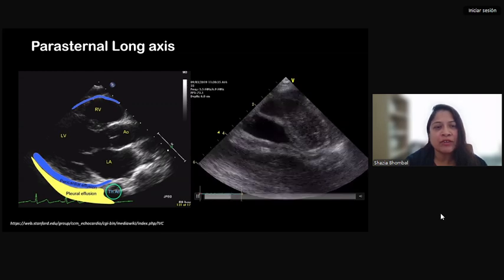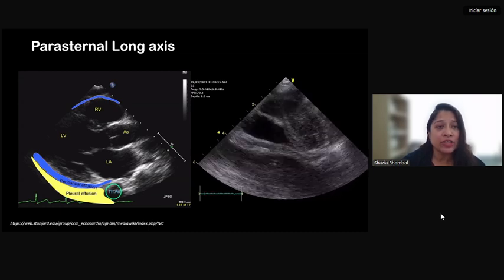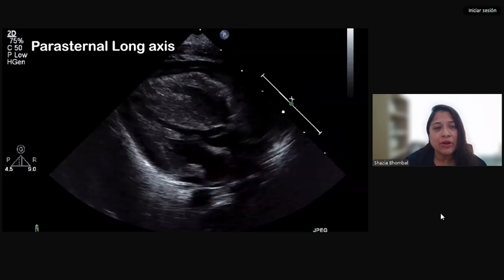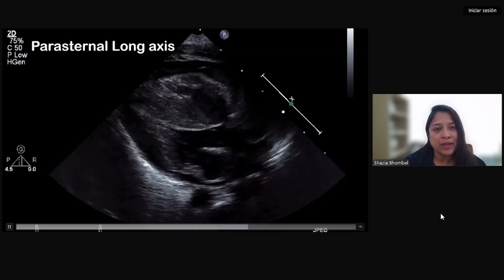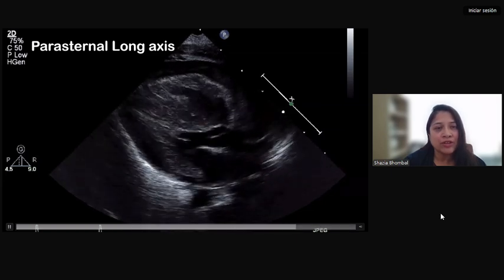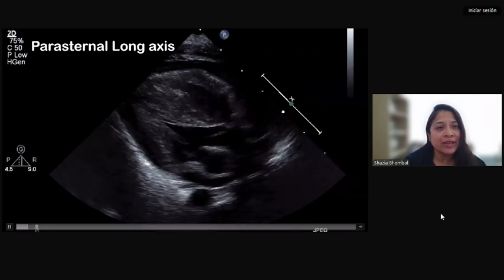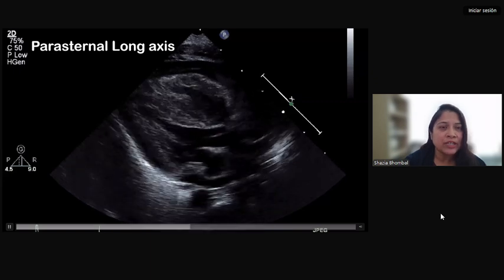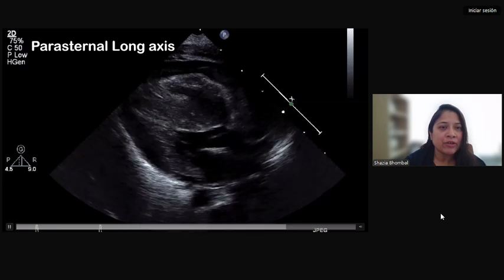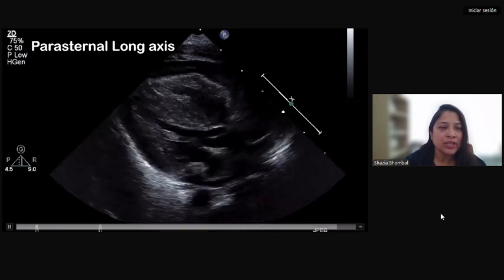And here, trying to recognize a pericardial effusion. Here's another example of a pericardial effusion, but also poor function. Again, the more normal you see, the more you recognize an acute situation when something is abnormal. So here's the right ventricle, thick, not moving very well. The left ventricle is not squeezing well, or is rather fairly underfilled. And you can see black around the heart. Here's some pericardial effusion. Here's your descending aorta, pericardial effusion in here.